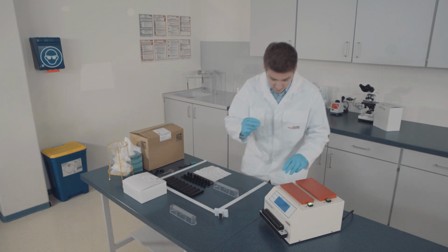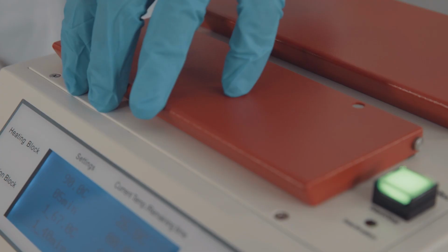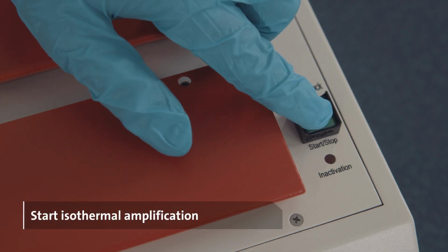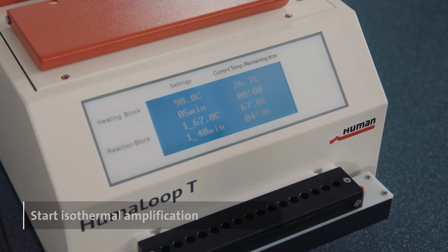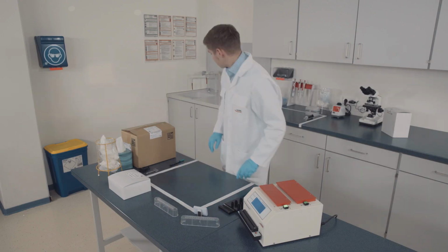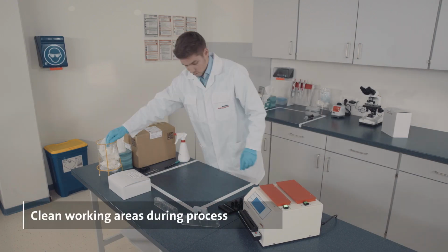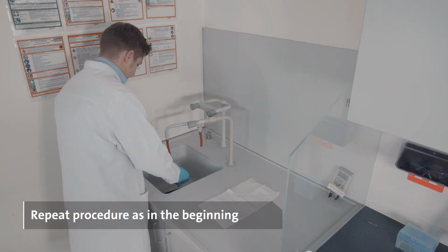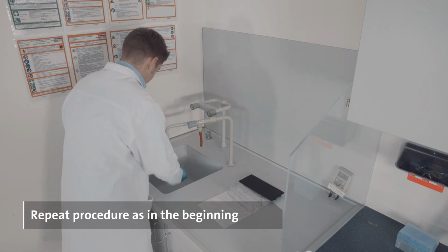Now put the tubes into the amplification unit of HumaLoop T and start the isothermal amplification. The amplification takes 40 minutes, plus the subsequent inactivation of the reaction for 5 minutes. Meanwhile, the working areas have to be thoroughly cleaned again with bleaching solution and distilled water. Perform the same procedure as in the beginning of the workflow.